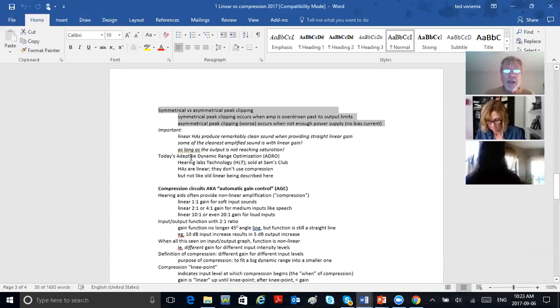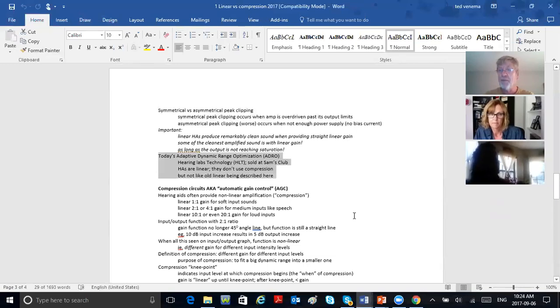And by the way, have you ever heard of Sam's Club? HLT, Hearing Lab Technology? They sell a hearing aid that uses something called ADRO, which means Adaptive Dynamic Range Optimization. Don't worry about memorizing it. But those hearing aids are linear, and they don't use compression. They provide either less linear gain or more linear gain, but they don't use compression to limit the MPO. It's a weird technology, and only Sam's Club sells it.